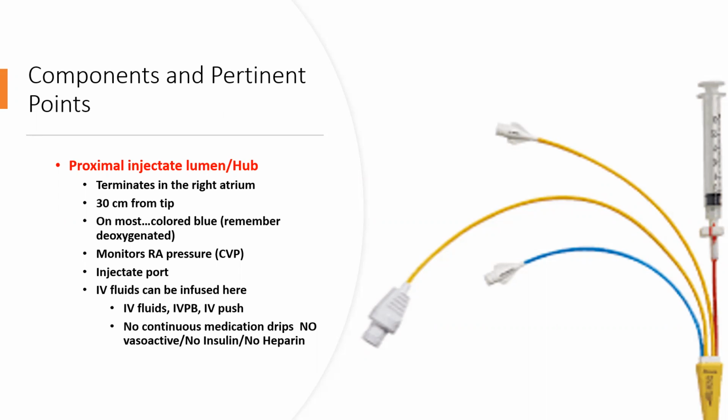Blood products may reduce the patency of this lumen, making measurements of cardiac output impossible. All right. So we would never use this to give blood or to give vasopressors. You could use the introducer port for that matter.